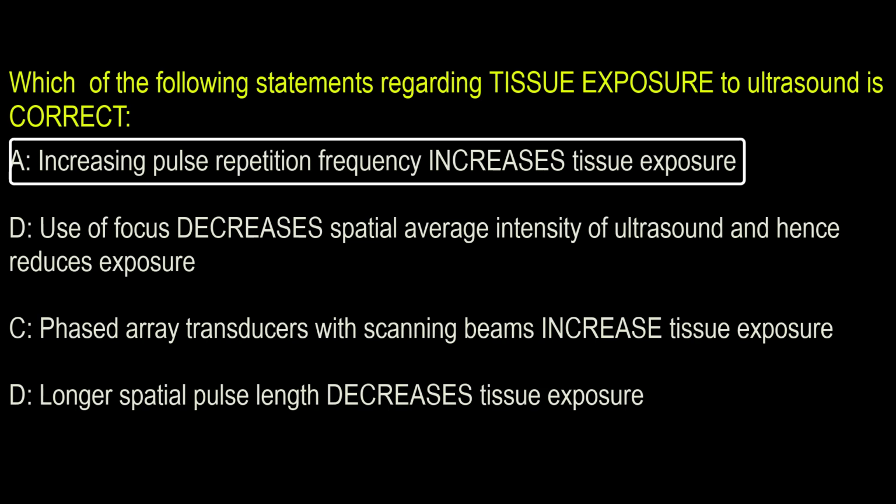So the correct answer to the question is that increasing pulse repetition frequency increases tissue exposure. Now let's go into the detail of each of these answers and have a didactic discussion regarding tissue exposure to ultrasound.